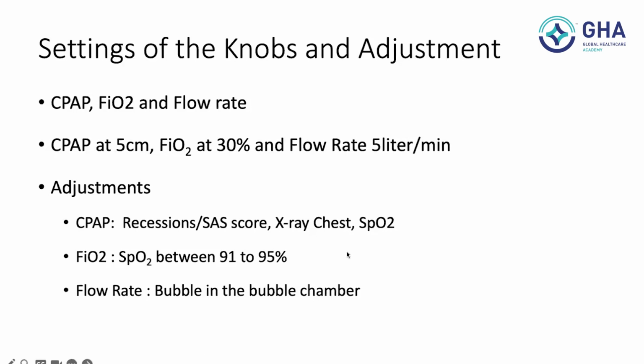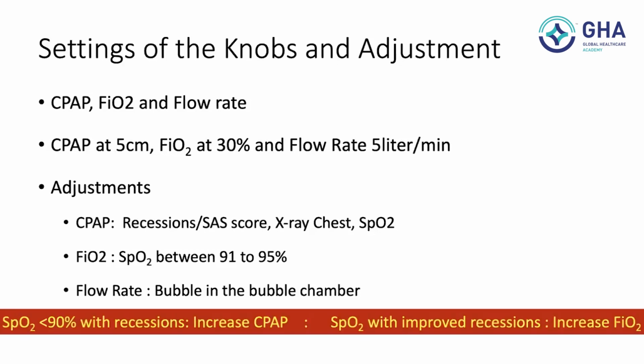So that's all. Once you have a respiratory score, work of breathing and hypoxia, our aim should be to increase the pressure. And before increasing the pressure from 6 to 7, see if there is underlying RDS. Apart from increasing pressure, you will give surfactant before going up further. For FiO2, you will increase only if there is no work of breathing and hypoxia is there. So that is what is shown in the lower graph.